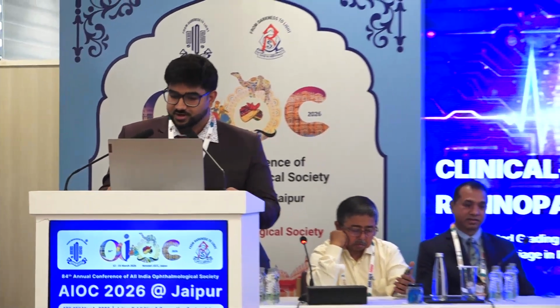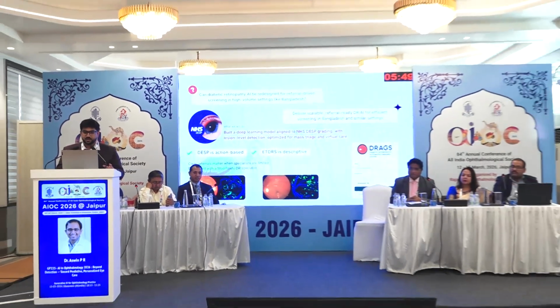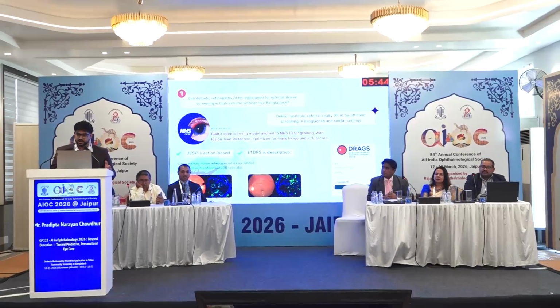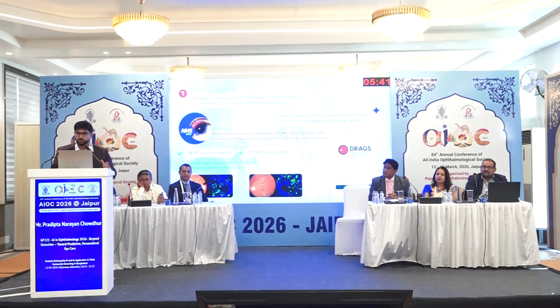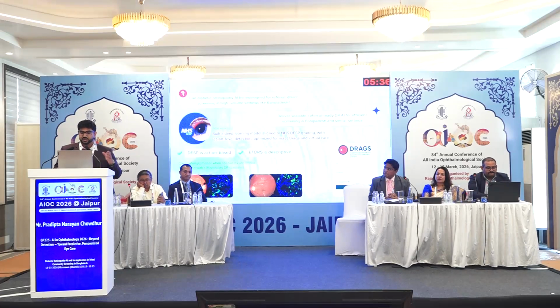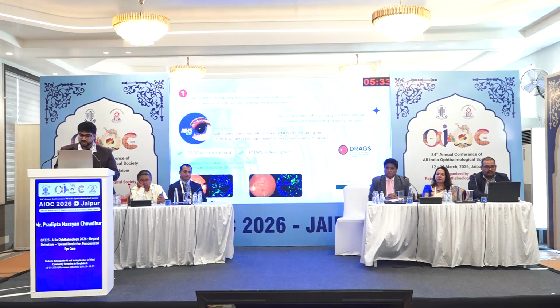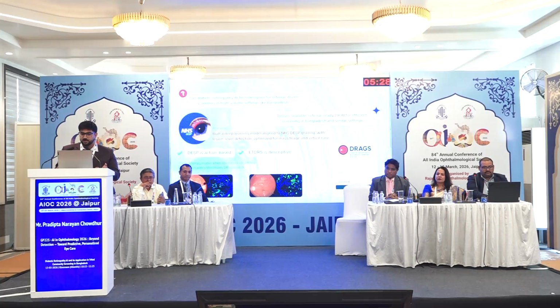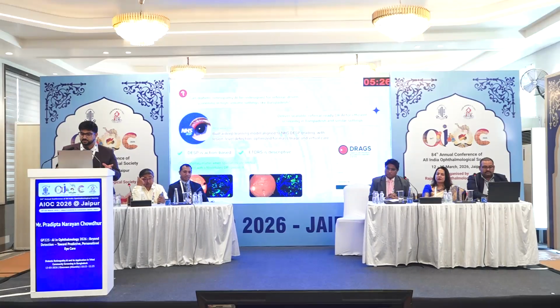Hello, hi everyone, namaste. Today I'm going to be talking about the clinical-grade diabetic retinopathy AI that we built in our hospital for the people of Bangladesh. Just like the problem in India, we have a lot of population that has less access to eye care, and a lot of it is in the most remote areas. So we thought we would use the power of AI to help with diabetic screening in rural communities. We built a deep learning AI model, but we aligned it with the National Health Service of the UK, the DESP grading.